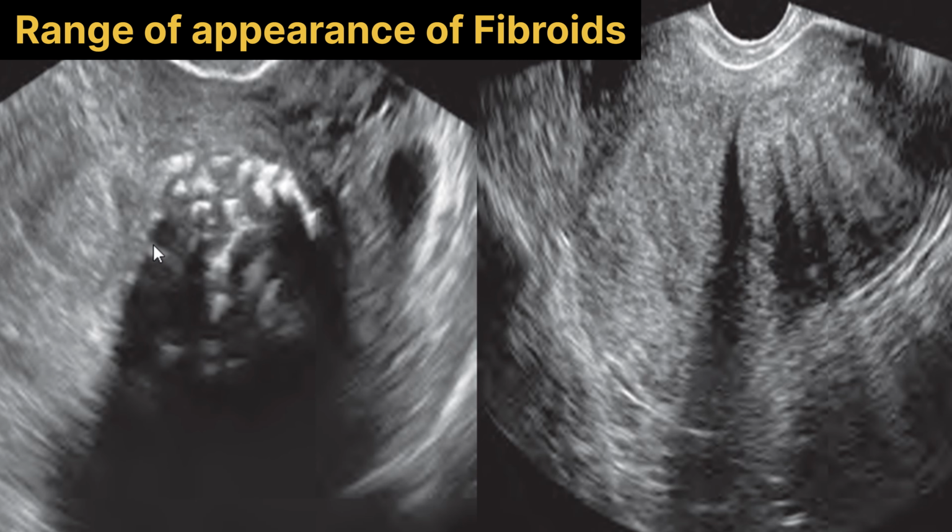miscarriage. Now, this is a transverse transvaginal image of the uterus which reveals multiple coarse calcifications with posterior shadowing in a fibroid, resulting in an echotexture that has been likened to the popcorn pattern. This popcorn pattern is due to the coarse calcifications.